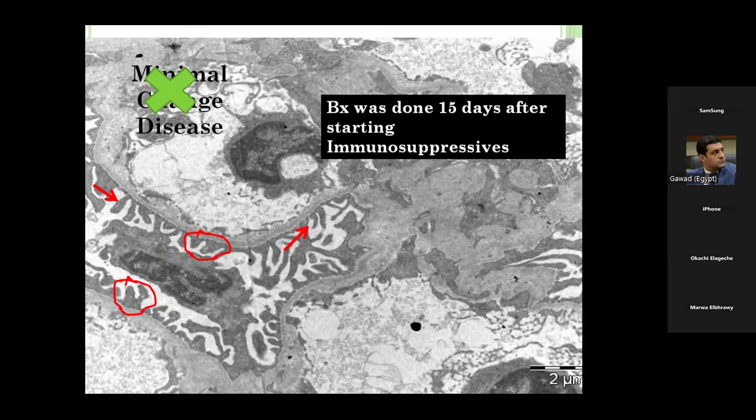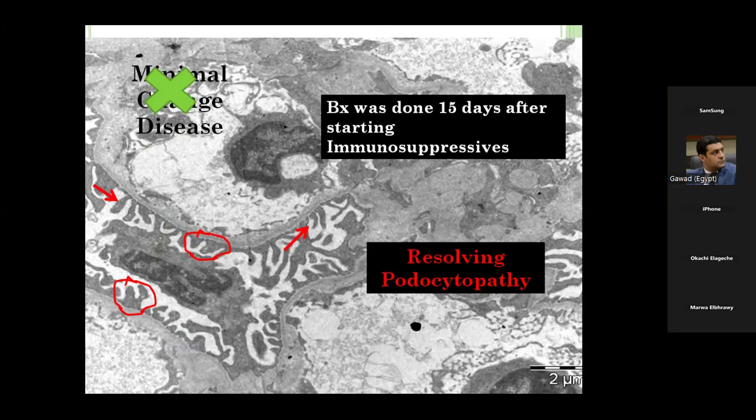When we asked our colleagues, they said that the biopsy was done 15 days after starting immunosuppressives. So it's a resolving podocytopathy. This is the resolution of effacement and the effect of steroids. After being totally effaced with loss of the finger-like projections of podocytes, they return to finger-like processes and look normal, and clinically this is reflected by resolution of proteinuria.